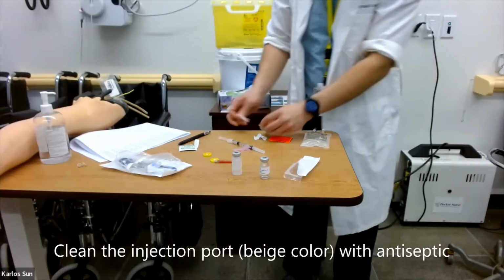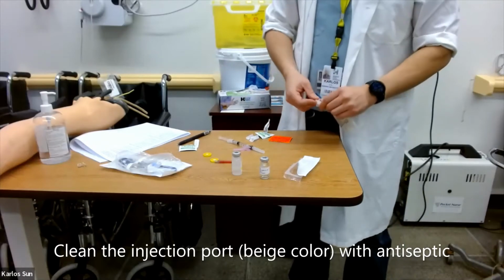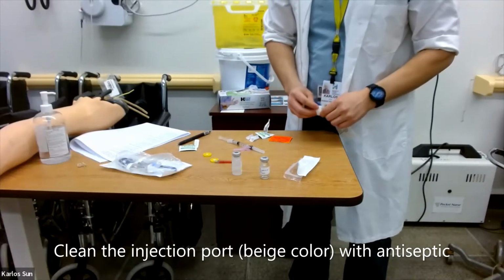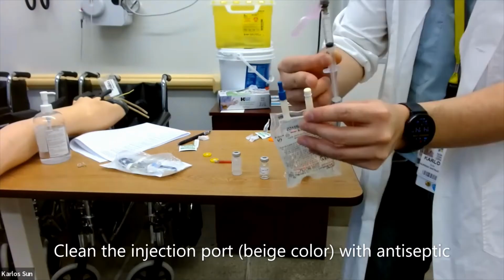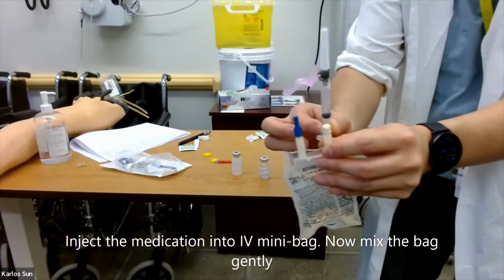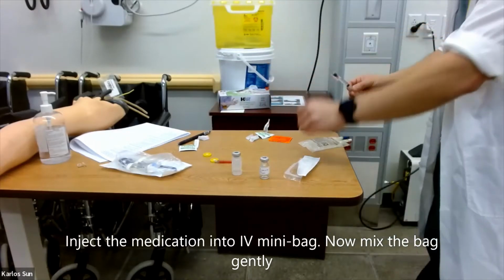Now clean the injection port in the IV mini bag with antiseptic. Inject the medication into the IV mini bag and mix gently.